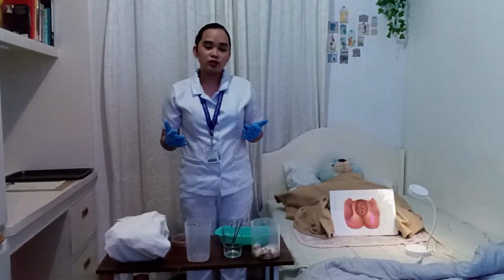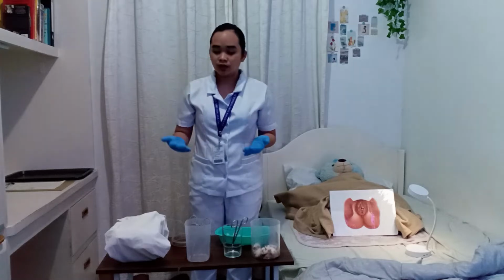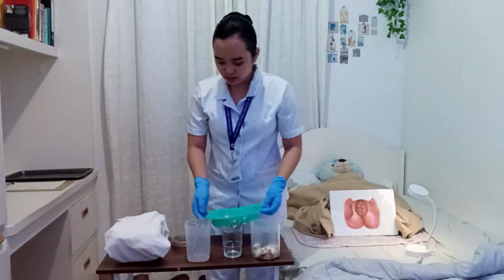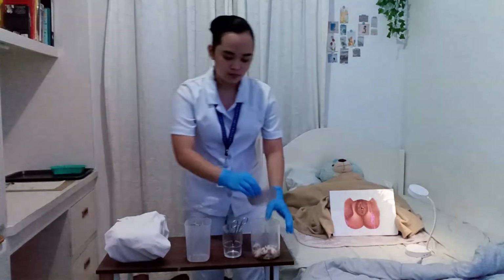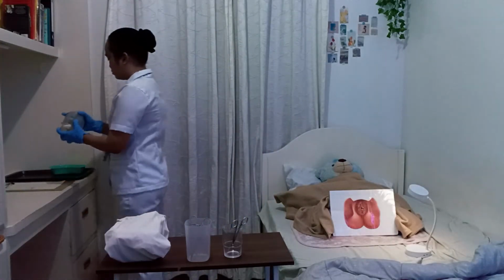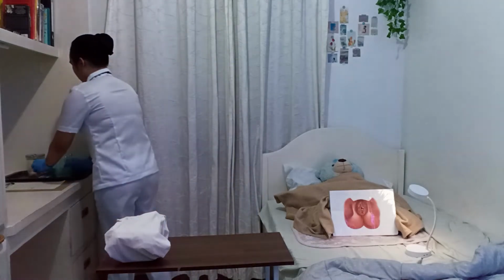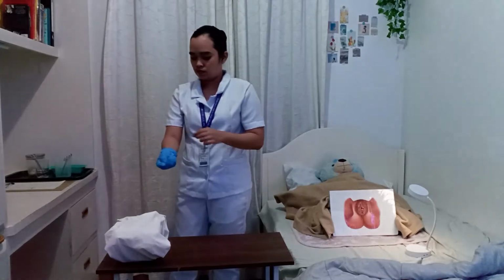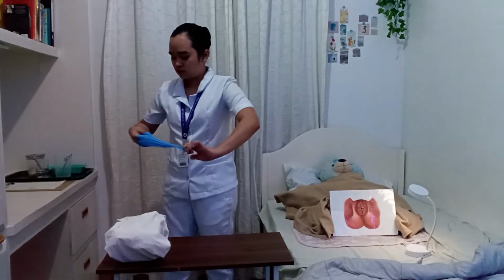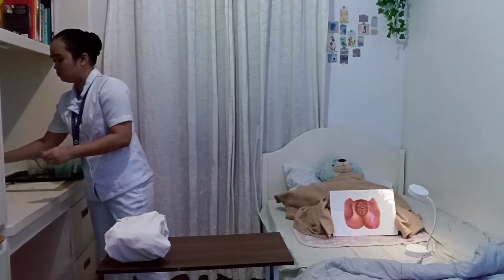Okay, so now we're going to open the tray set while observing the proper sterile technique to maintain the sterility of the materials. But before that, we're going to set this aside first. Okay. And then I'm going to remove my gloves. I'm going to perform hand hygiene.